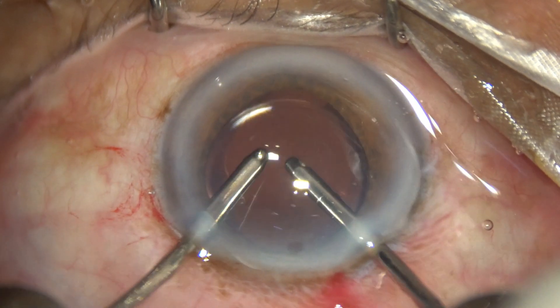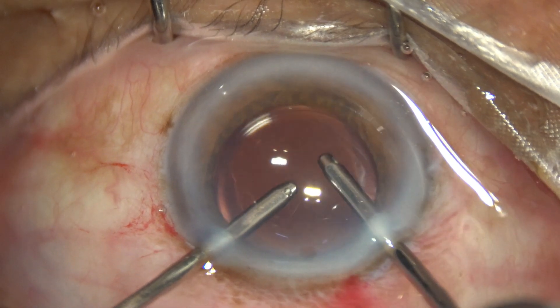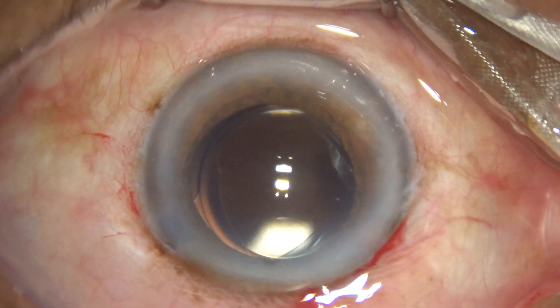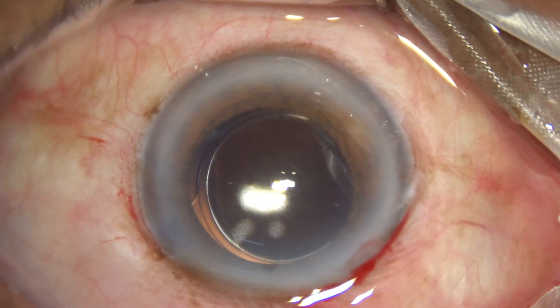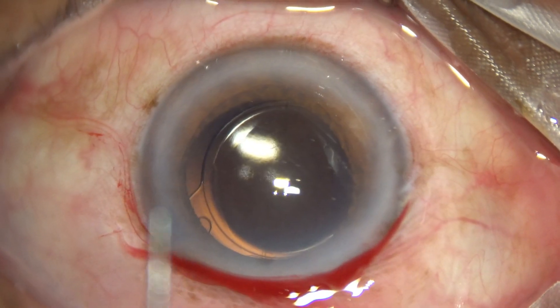Since I usually make only one side port, I take help of the main wound for irrigation. The trick is that the anterior lip of the main wound should be lifted gently so that fluid leakage from the main wound is reduced, balancing the aspiration.